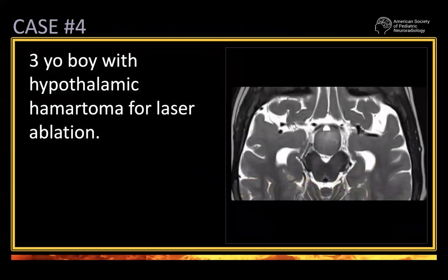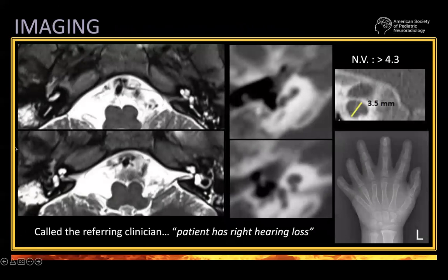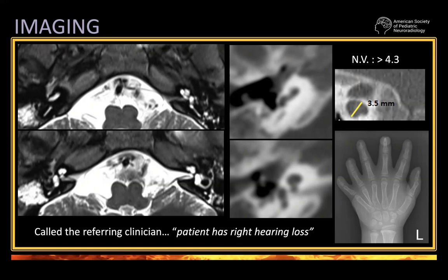Case four: a three-year-old boy with hypothalamic hamartoma for laser ablation. You can see the hypothalamic hamartoma. However, this is the inner ear — we have only a few sequences. The cochlea is small and we called the clinician. The patient has right-sided hearing loss. This is the appearance of the hand — something is wrong with it: we have six fingers here. This ear looks normal; this one looks frankly abnormal. These are not images tailored for the temporal bone — both CT and MRI — but just brain images.